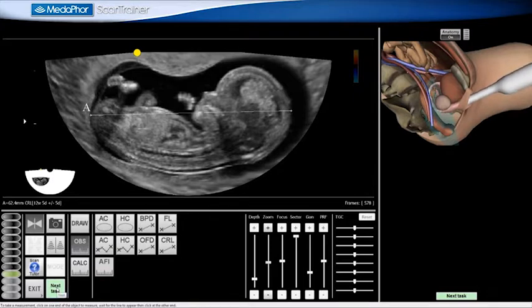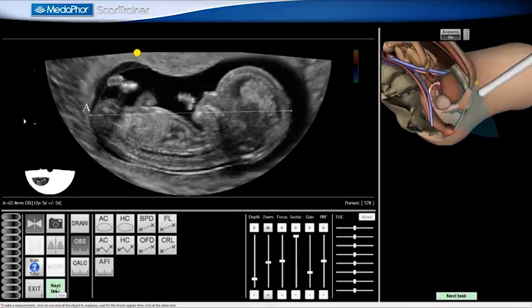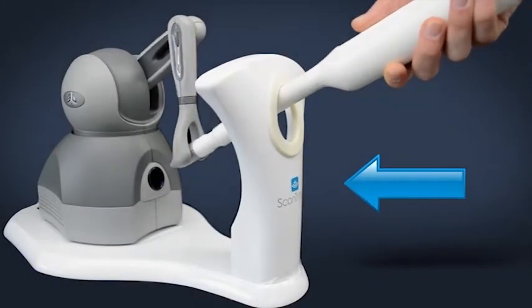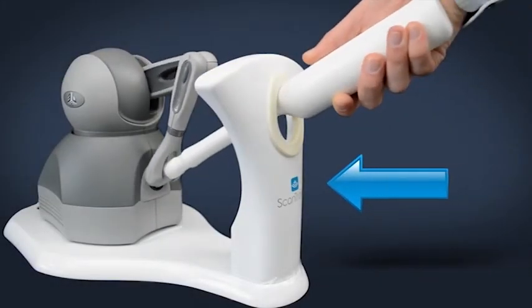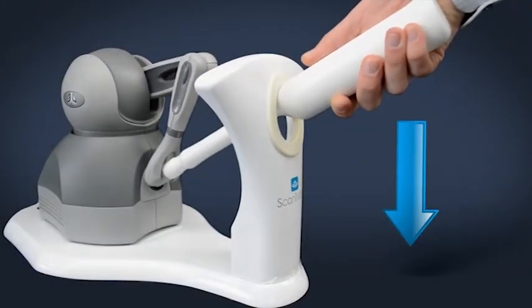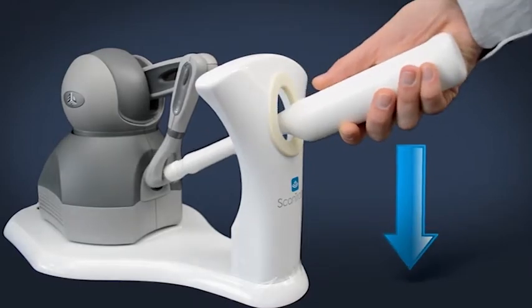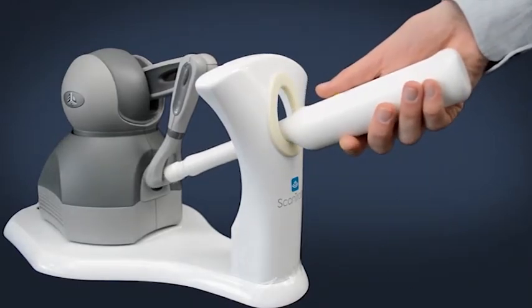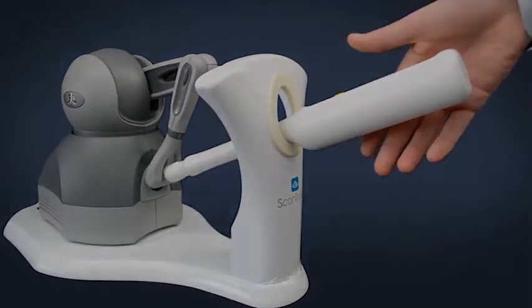I then withdraw the probe to complete the scan. I now re-dock the probe by angling it towards the top of the restraint and then lowering it into its docked position.